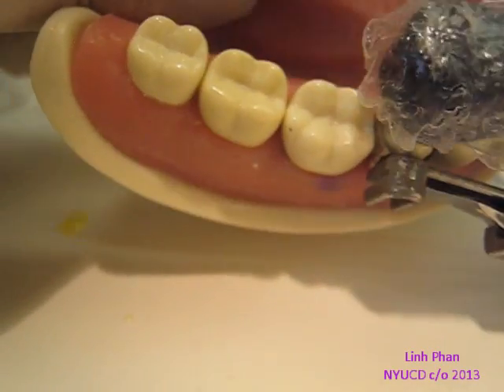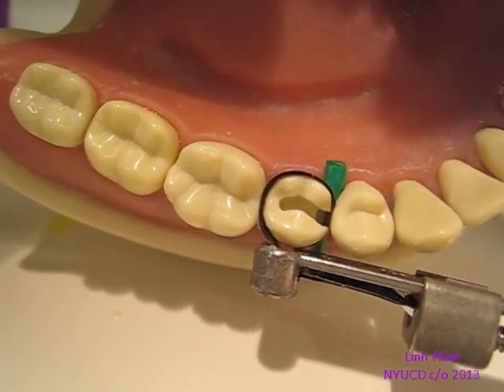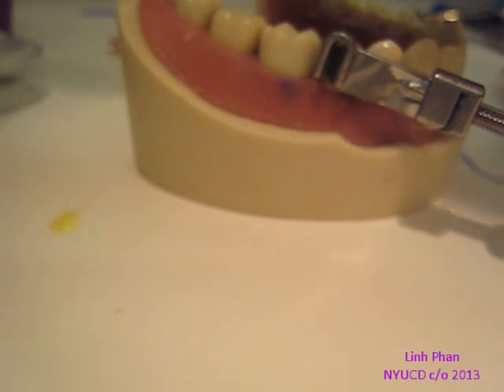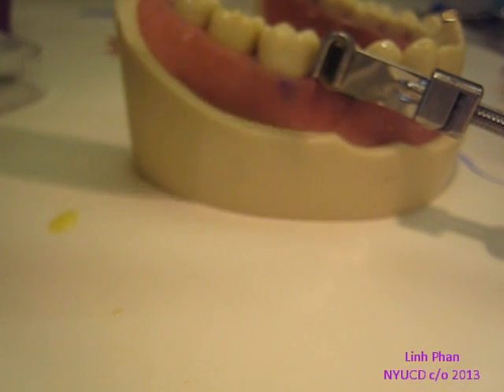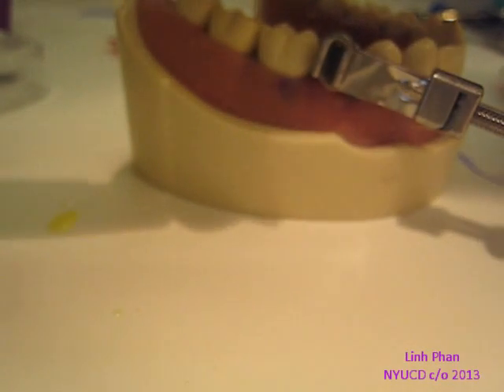Cure on 20 seconds. Close your eyes, everyone. So the next thing we're going to do is take some composite. Some people like putting it on the table; some people like putting it right in the tooth. I don't really like doing that. I don't like putting it on the table because I think there's a lot of stuff on our tables and it gets really dirty.